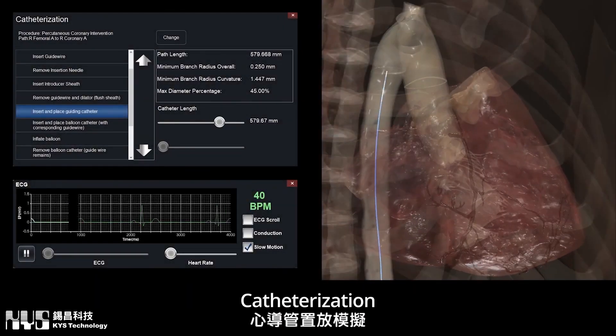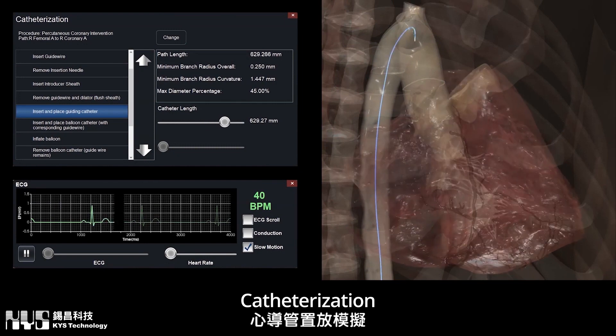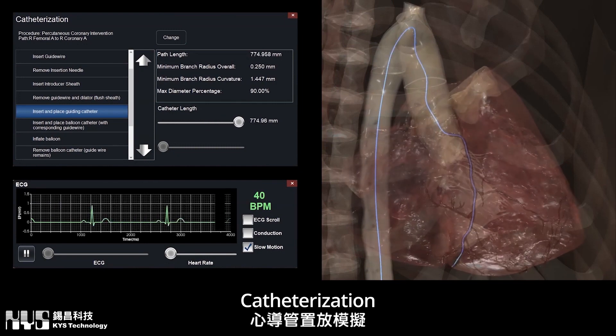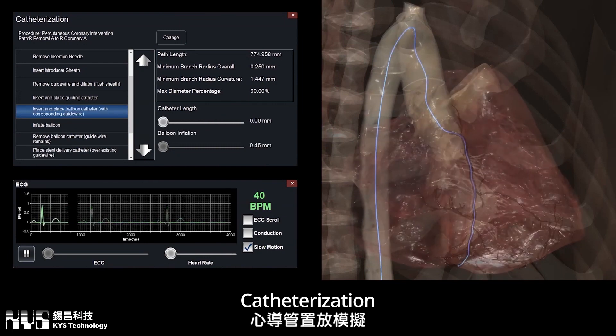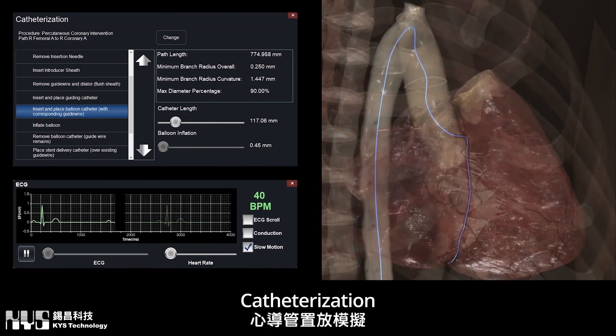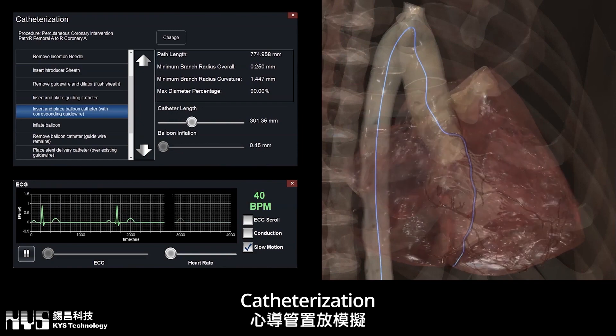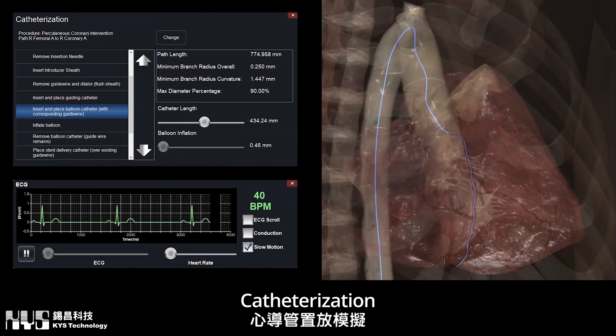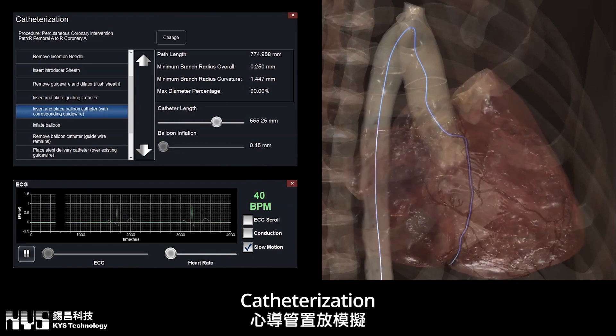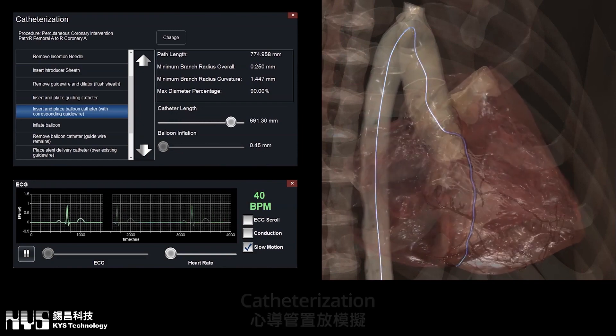Our clinical simulation suite includes a catheter providing the practical experience of how catheterization is performed on a real human body.